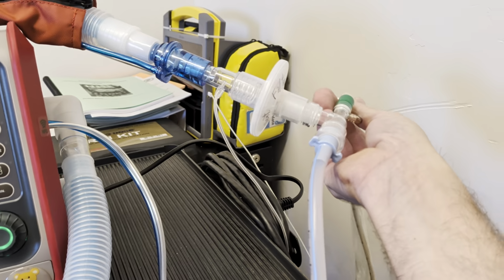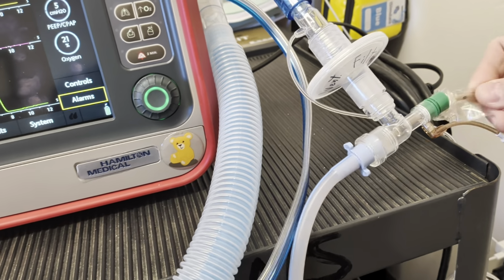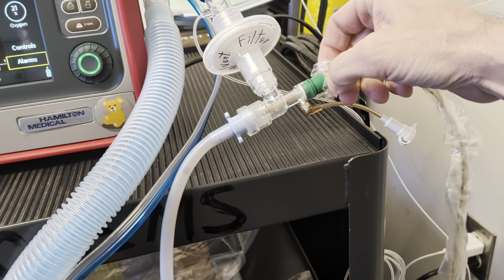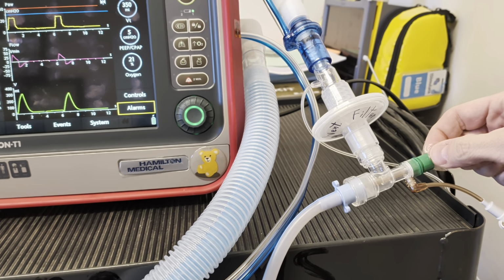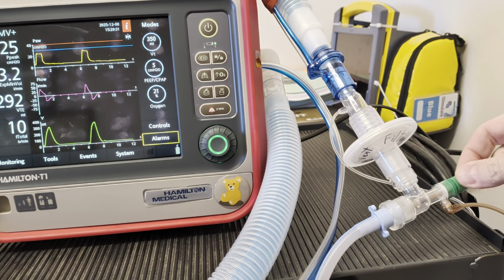Sometimes your inline suction gets dislodged or left in the endotracheal tube, and that can cause some obstruction as well. P is pneumothorax, and then E is some sort of critical equipment failure.